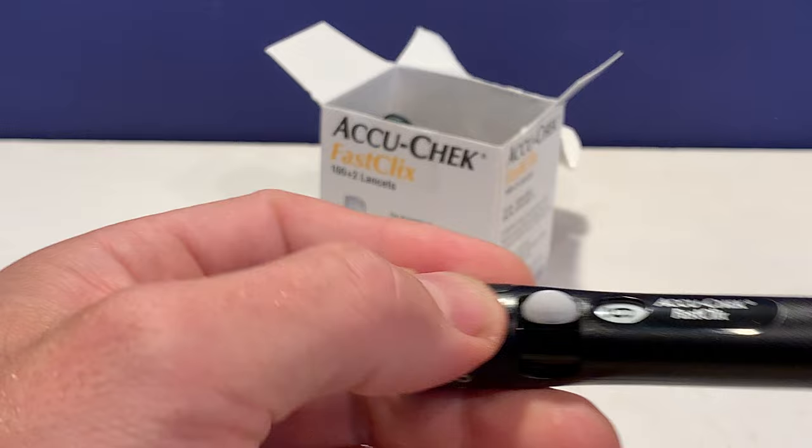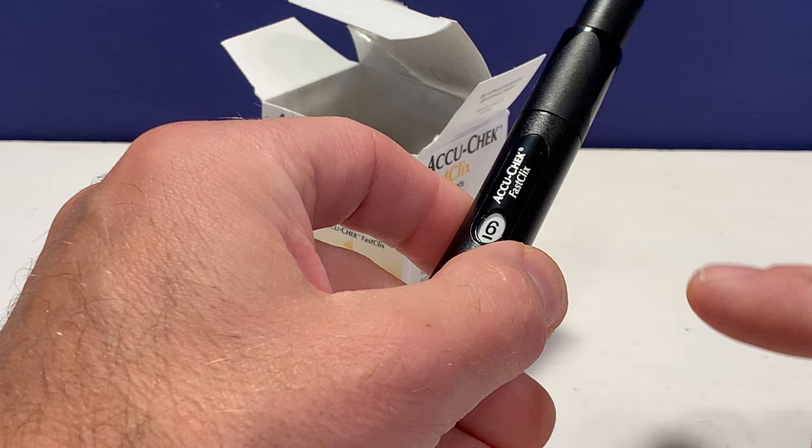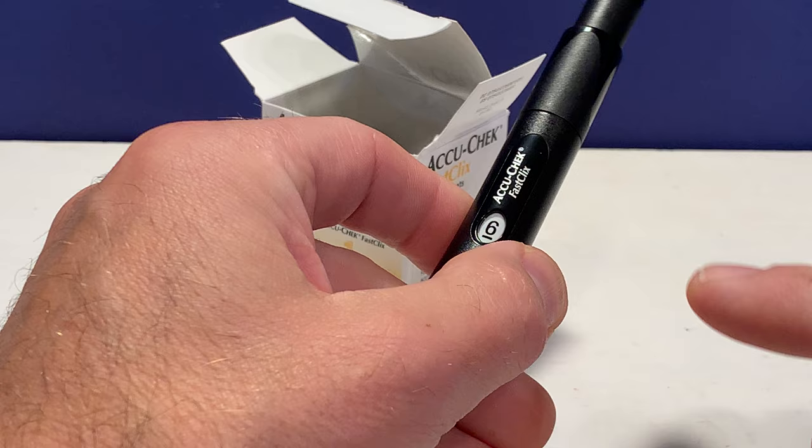The Accu-Chek FastClix is really nice. They have what they call a Clixmotion, which controls the lancet going in and out in a controlled fashion, and it is a lot more comfortable. I was surprised by the noticeable difference when using this as opposed to traditional lancets.